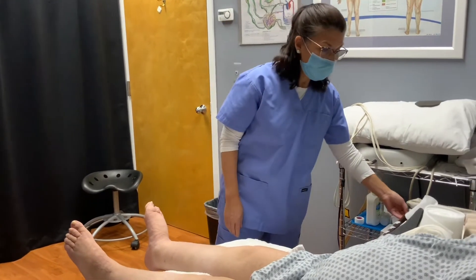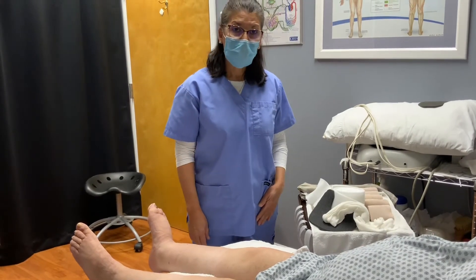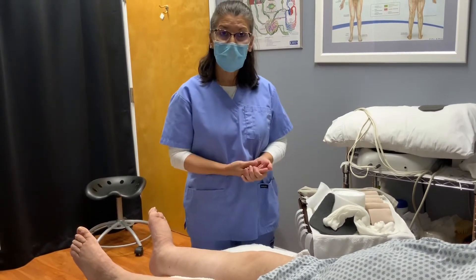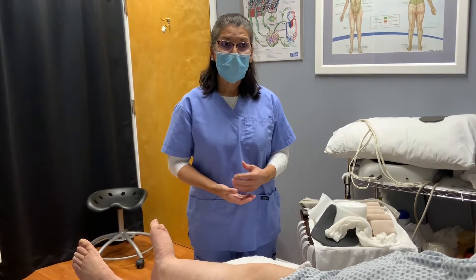The first thing you want to do is have all your supplies ready before you get started, and of course, explain to the patient what the purpose of multi-layer bandaging is for.